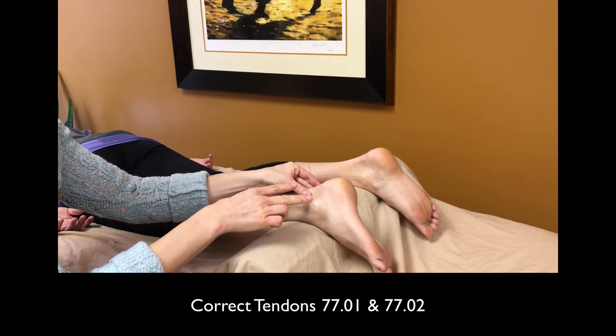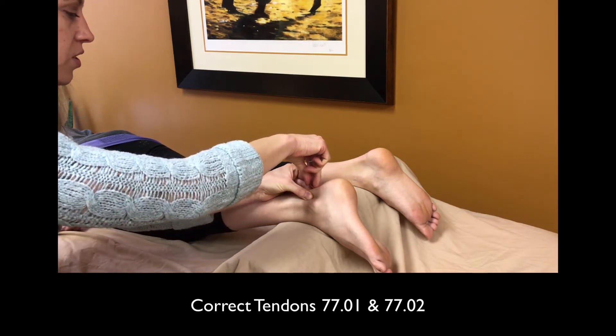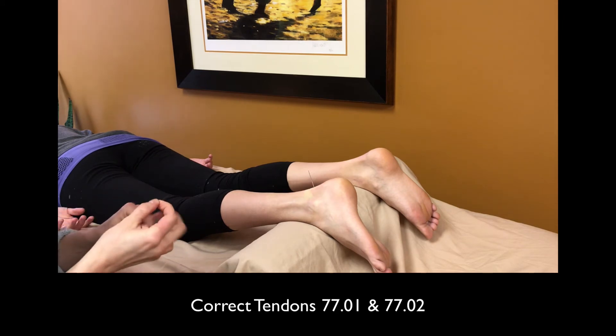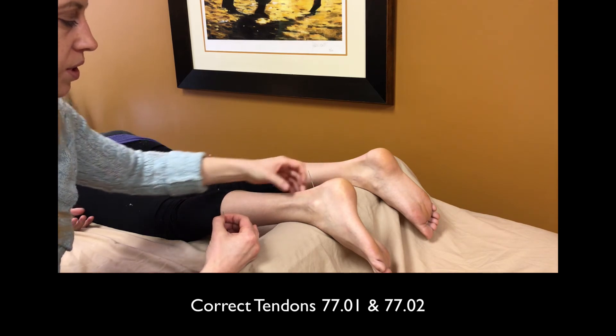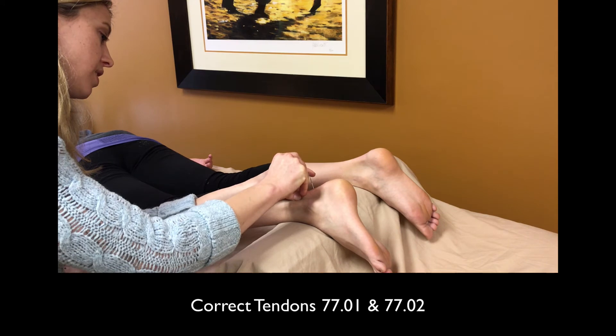Once you have that, you want to continue to hold the tendon and you're inserting it straight in. From there, you can move up to the next point and do the same thing.